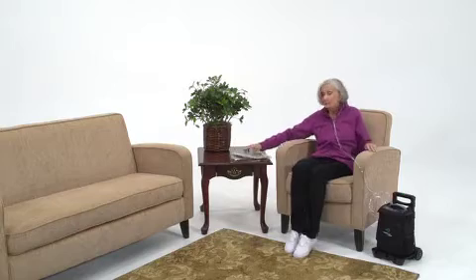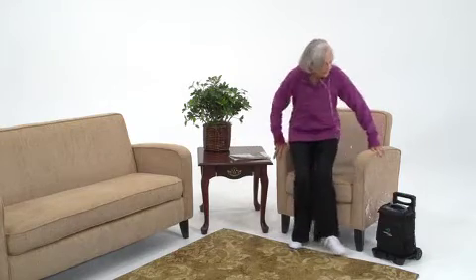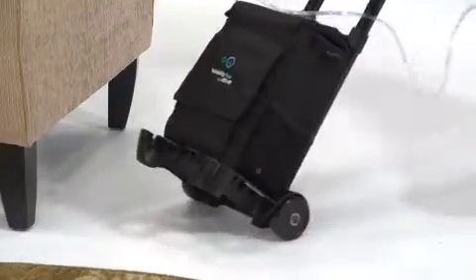Unlike most POCs, the Oxus can deliver the same amount of oxygen with every breath you take. So as you breathe faster and need more oxygen, the Oxus Reliability Plus delivers more oxygen.